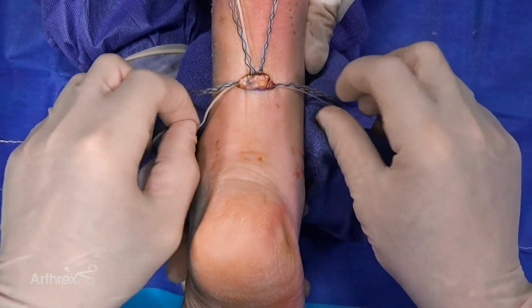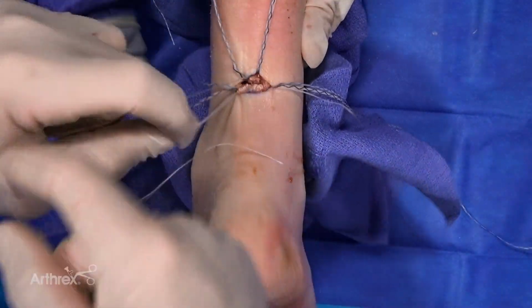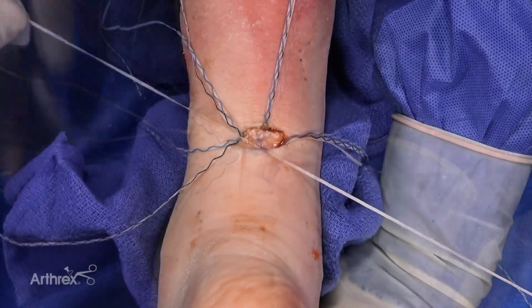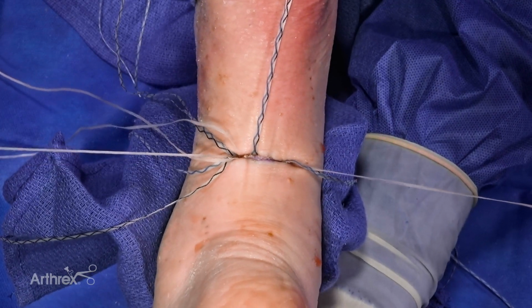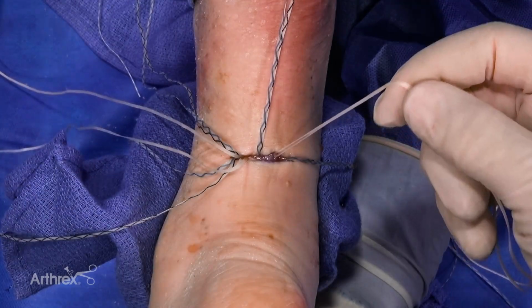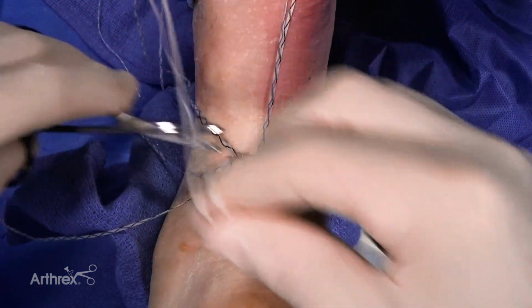So let's go ahead and we'll take the white first, and we'll tie that one down. So what I'll do is you want to form a knot stack on one side. And again, you're just laying a knot down because there's no tension on the other side. And so I'm doing that. Again, it's nice and soft. So now on this side, I'm going to be pulling against the knot that I just created and tensioning maximally. So you can see there, plantar flexion and then laying that down. So once I have those in place, I'll go ahead and cut them off. I want to get them out of the way. Makes it easier just to have them out of the way, and I'll do that just above the knot itself.